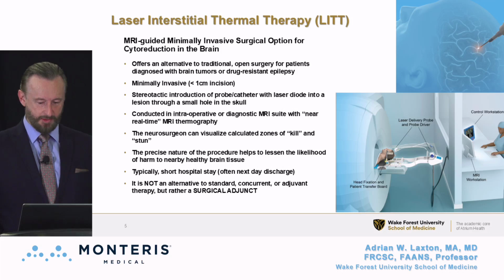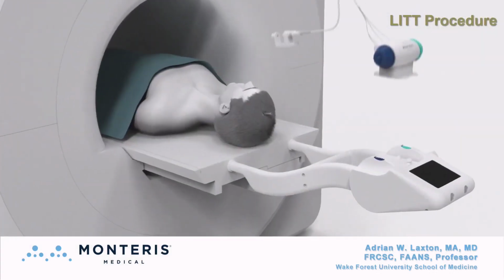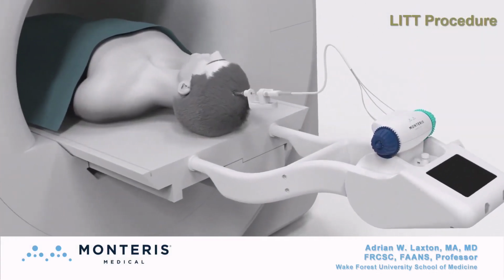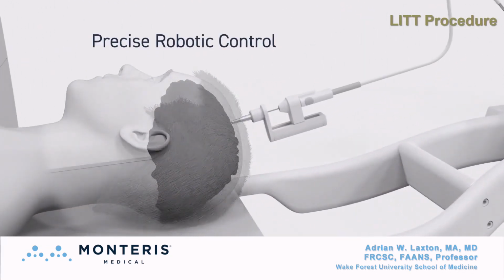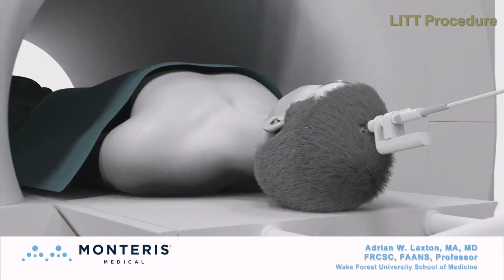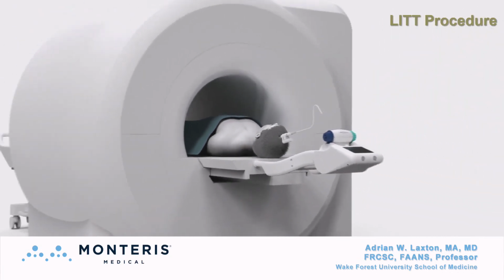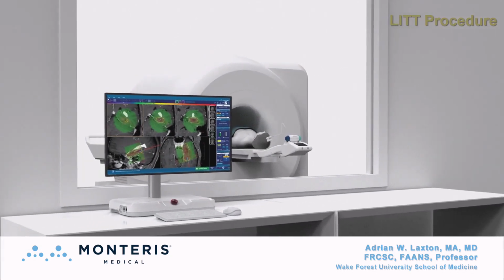So we'll just take a quick video of what's involved in this procedure. Here's our patient. That's called the robotic probe driver, and they have the guide bolt. The laser is being placed into the lesion in this case. This is an example of the side-fire probe, which was a unique feature of the 3.3 millimeter NeuroBlate probe. And again, the patient obviously would be in the MRI for the actual procedure.